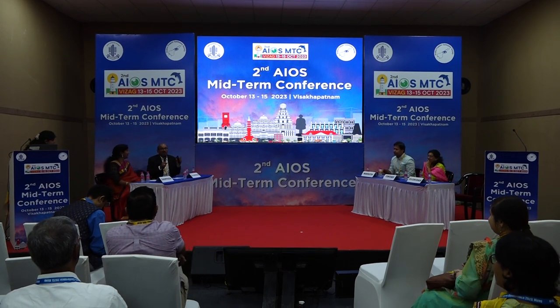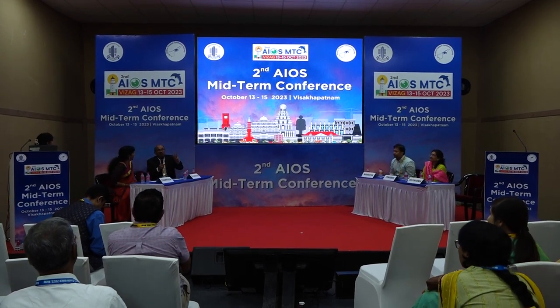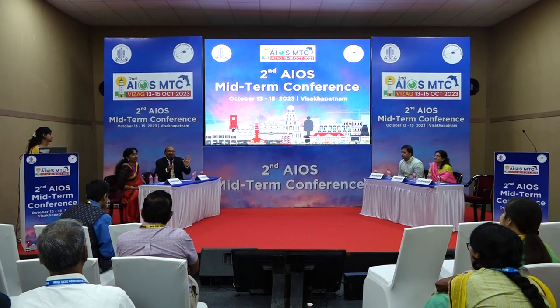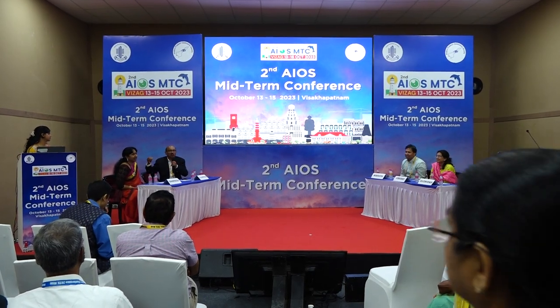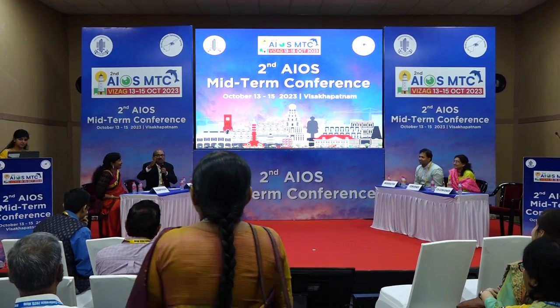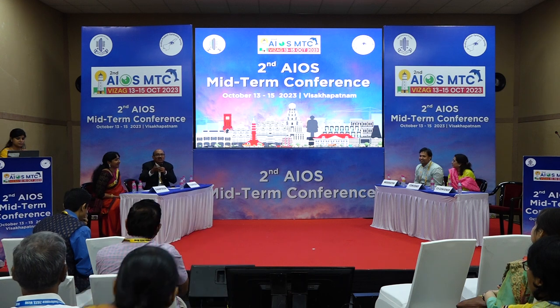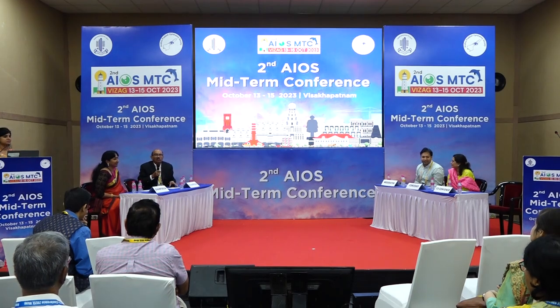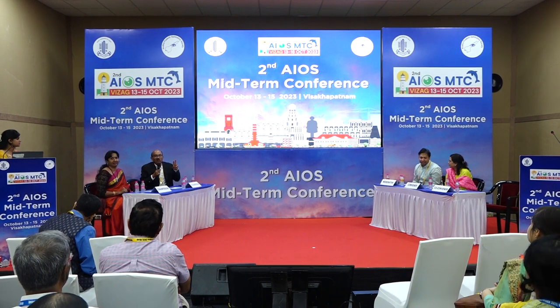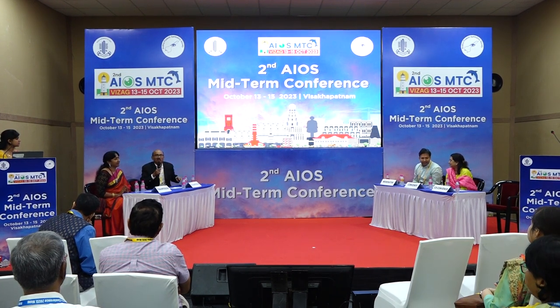Nowadays, only in the last 2 months, I have seen 3 opacified IOLs. So be careful in selecting the company. So this fellow pushes with the new company, and free of cost, you take some samples and implant. So after 3-4 years, you face the problem. So be careful about this opacification of the lenses. In a span of 2 months, I have seen 3 cases.